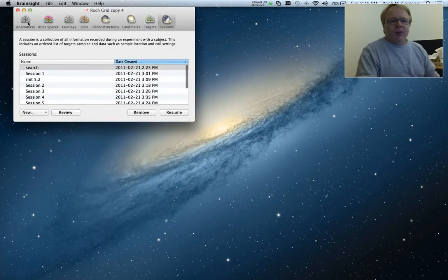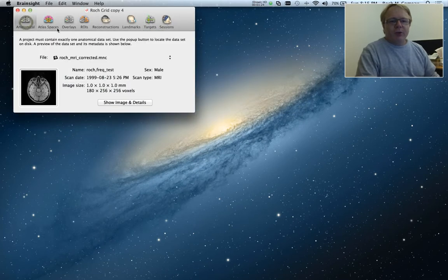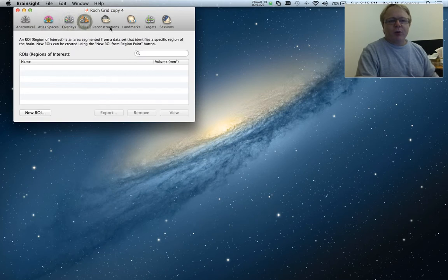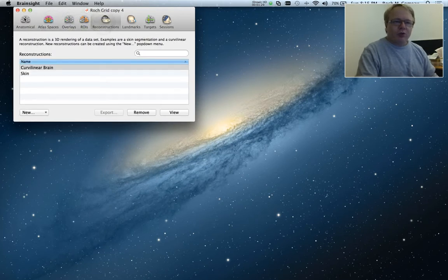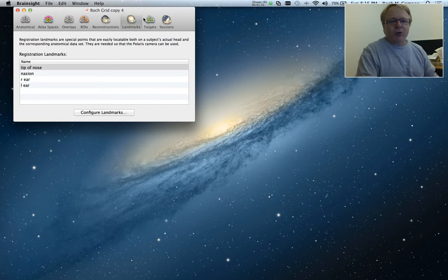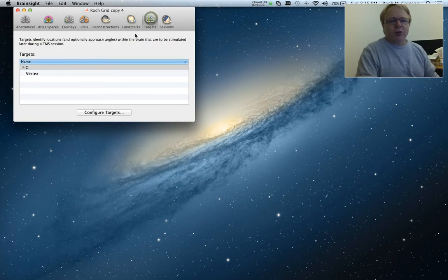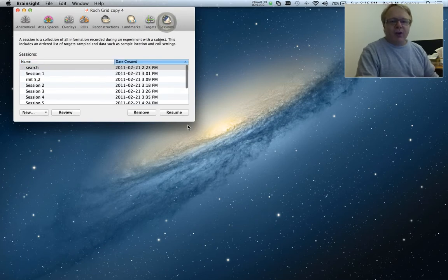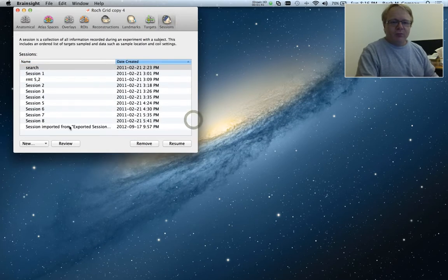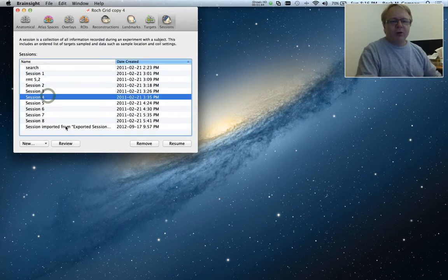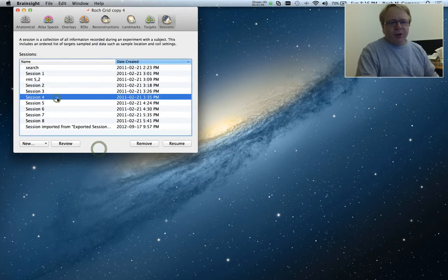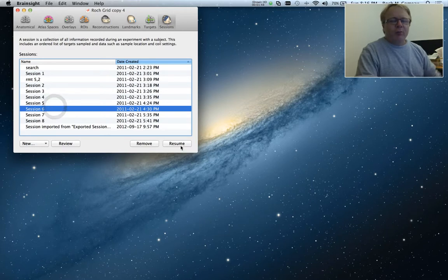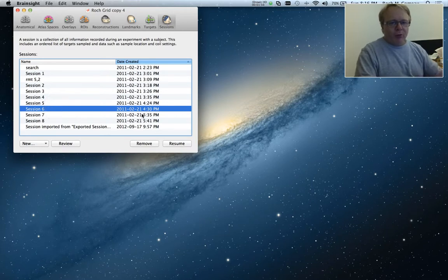So I'll simply select Open Recent Project. Now if we look here, we've done all the same things that we did in the previous project, where I created some 3D reconstructions, created some landmarks for the registration, some targets for stimulation, including a large grid over my motor area. And if we look at the sessions, we've created many TMS sessions. I can go to any session here and click resume and pick up where we left off had we been interrupted for some reason.